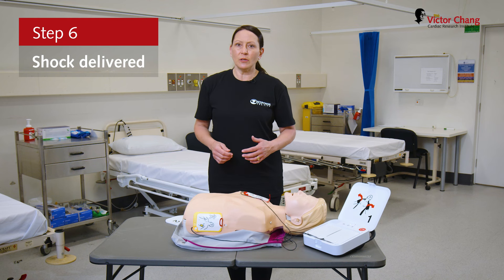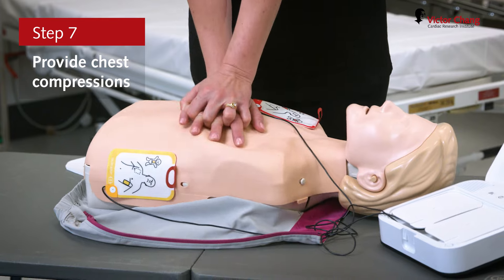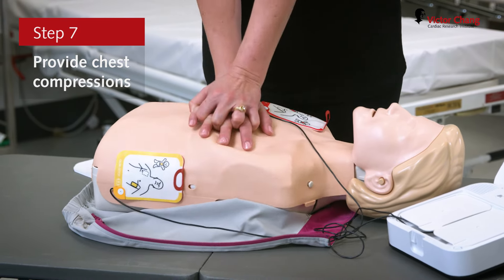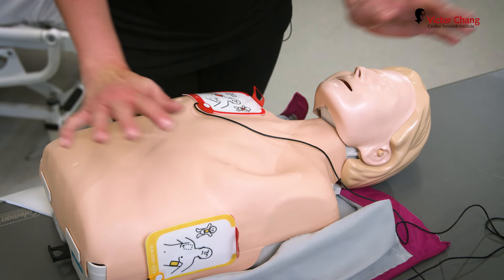If the shock was not successful, we need to continue with CPR. Provide chest compressions to the beat. The heel of one hand should be in the centre of the chest, with the other hand on top of the first hand. Push down hard at least five centimetres, then stop chest compressions when prompted.